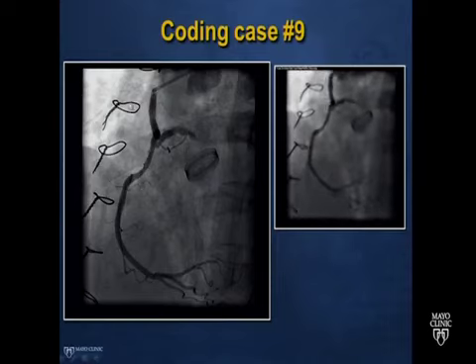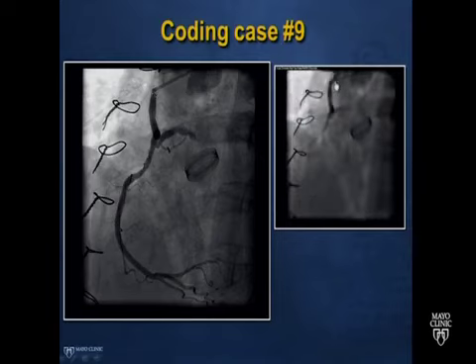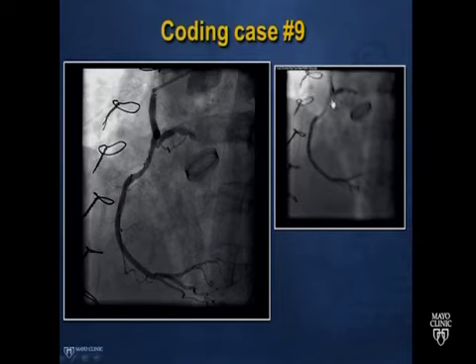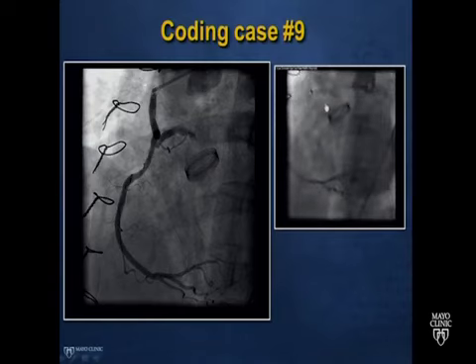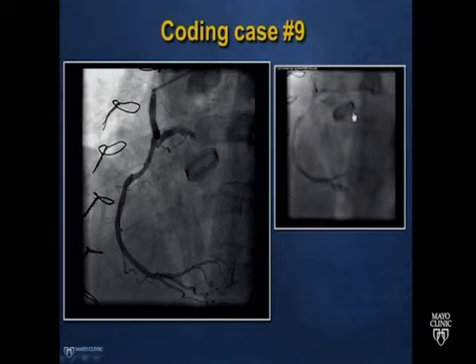So this one is a bypass graft to the right. It's a very short bypass graft, but the main thing I want to emphasize here is that bypass grafts will not have branches and they will be outside the cardiac silhouette. So before anyone confuses the native right versus a bypass graft, first determine whether or not it's outside the cardiac silhouette. And here in this video, one can clearly see that this is coming down an anastomose to the proximal right, and the native coronary artery is actually filling retrograde and emptying to the root here.